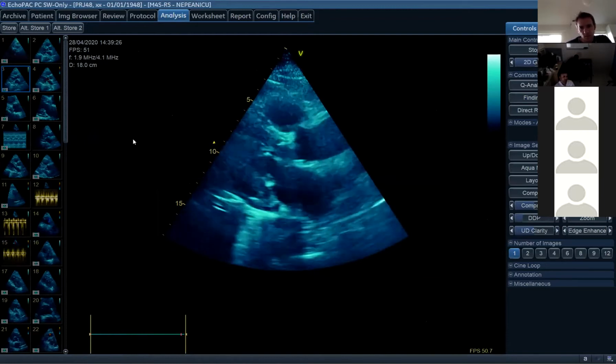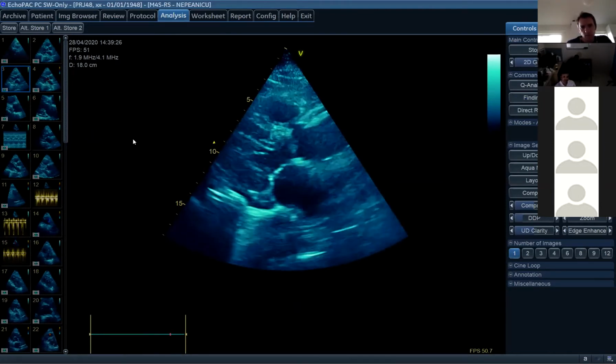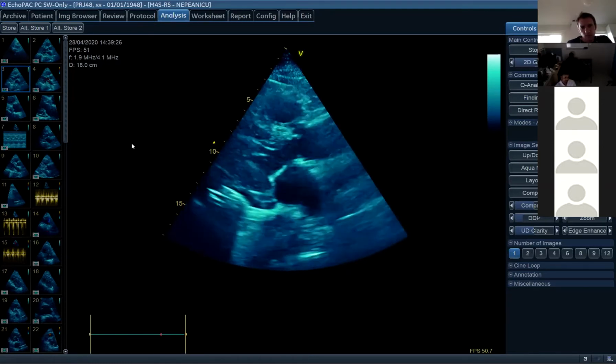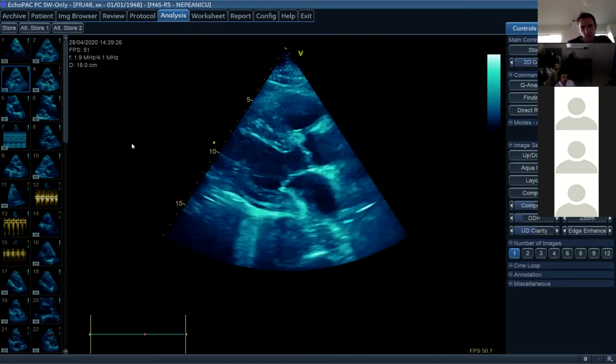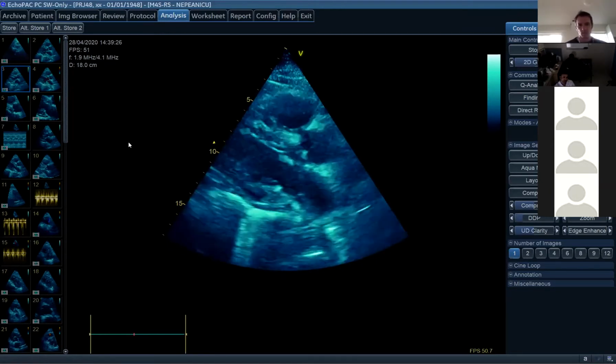And this was an echo because they were intubated and on escalating levels of inotrope with a high lactate, so in go-going shock. And so this is again a patient who could be included in the study that I'm doing on septic cardiomyopathy because they're meeting all the criteria for septic shock and things. Tell me what you think of this echo?